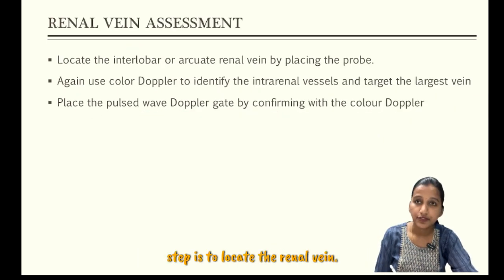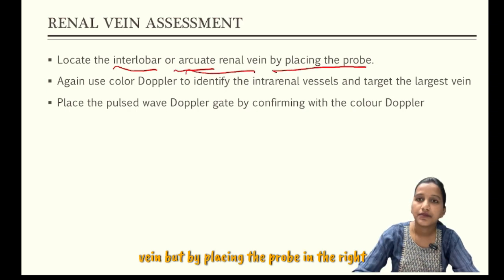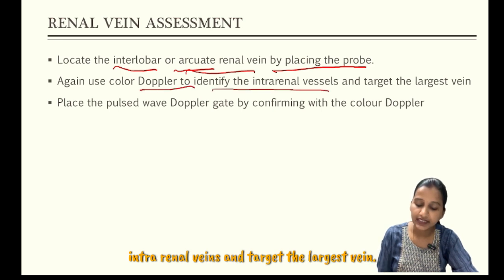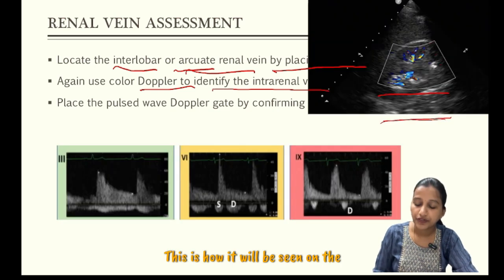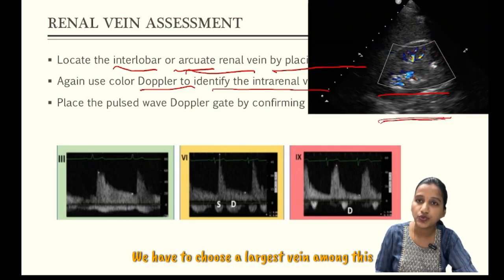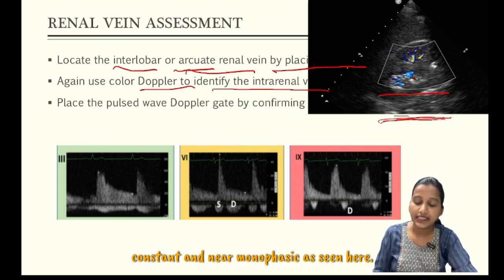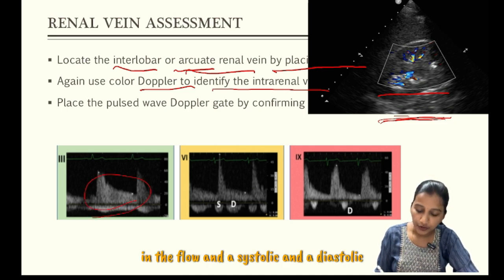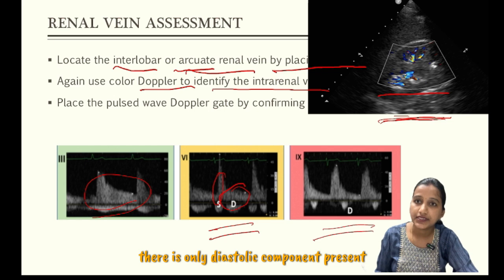Next, coming to renal vein assessment — locate the interlobar or arcuate renal vein by placing the probe in the right posterior axillary line. Use color Doppler to identify the intrarenal veins and target the largest vein; the flow will be away from the probe and hence will be seen as blue color. Choose the largest vein and place the pulse wave Doppler gate. Normally, intrarenal venous flow is constant and near monophasic. Mildly abnormal tracing shows interruption in the flow and a systolic and diastolic component. With severely worsening congestion, there is only a diastolic component present.